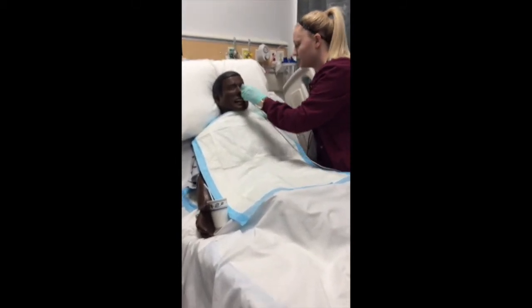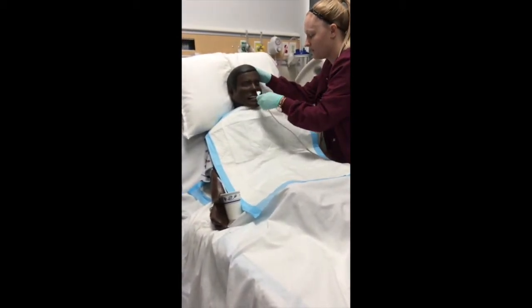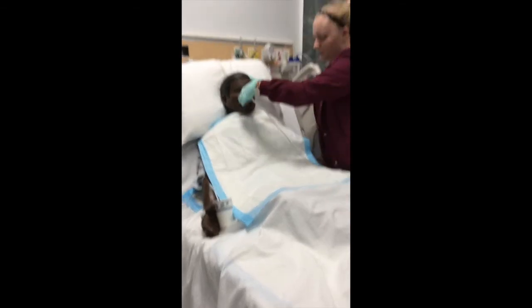Okay, and I feel resistance, so go ahead and tuck your head and swallow for me. They're going to have this up here. Swallow, swallow, swallow. Okay, now I've reached the tape.